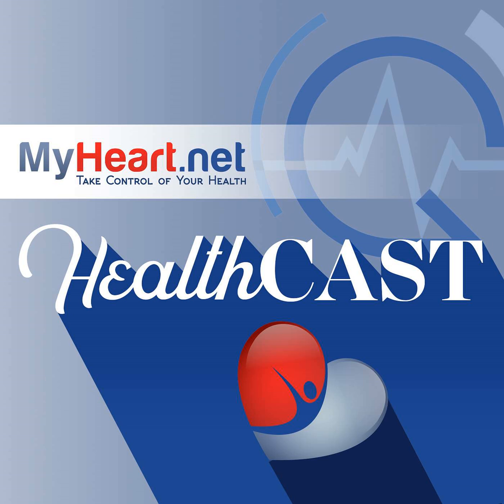Once the study is done, you send the study to HeartFlow. And of course, they have their algorithm, use the supercomputational model based on CCTA, blood flow solution, and they will send you back the data, nice colorful images. The turnaround time now is around 4 hours or less. It used to be 24 hours, but even 4 hours is kind of high if you're looking at an acute coronary event.